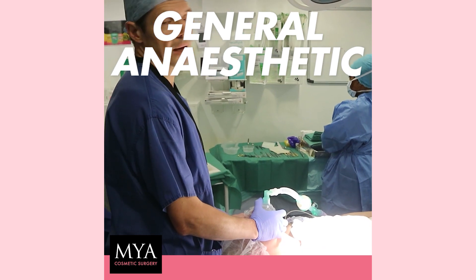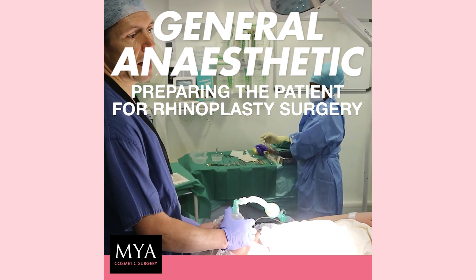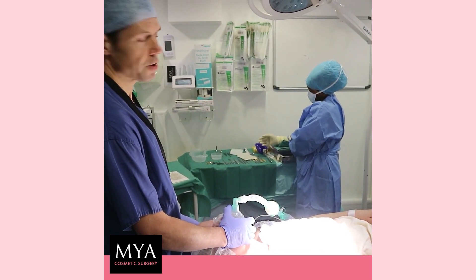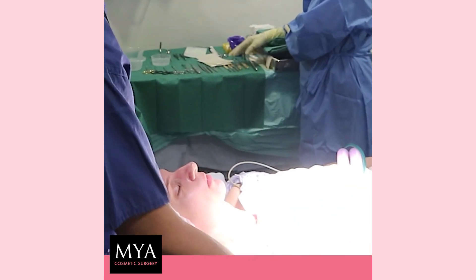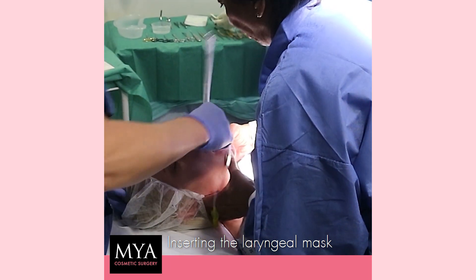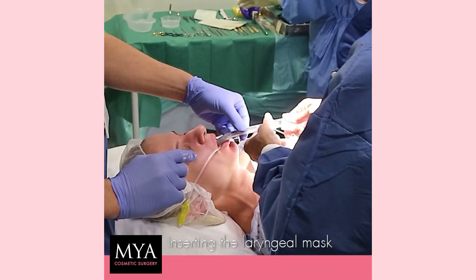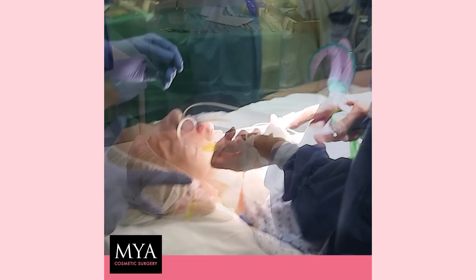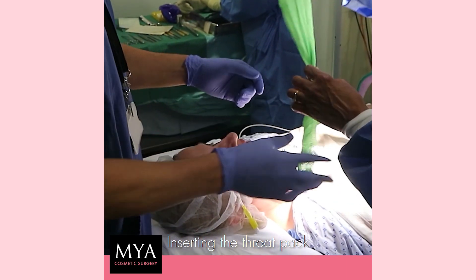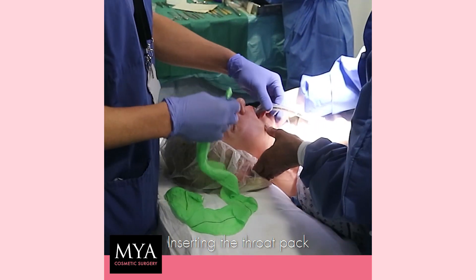So the patient is asleep now? Yeah, the patient is asleep. We're going to insert what is called a laryngeal mask — it's just an airway device that we use to manage the patient's airway and assist breathing during the procedure. And now we're going to insert a throat pack to collect all the blood that drips from inside of the nose during the procedure, so it doesn't affect patient breathing when they wake up.